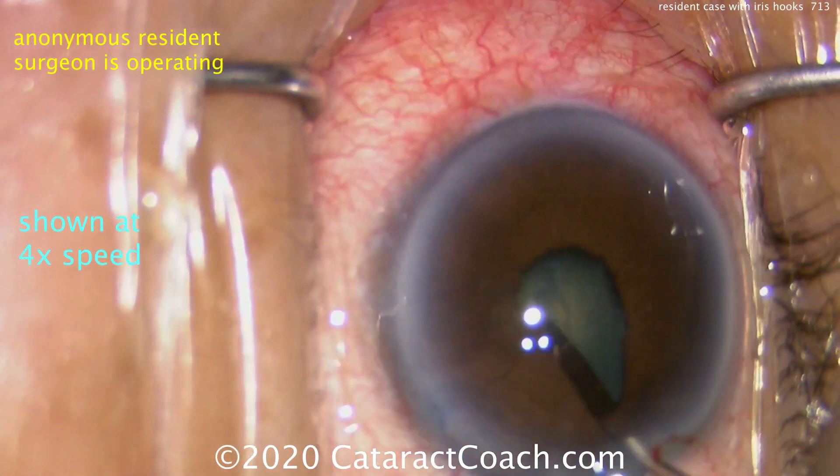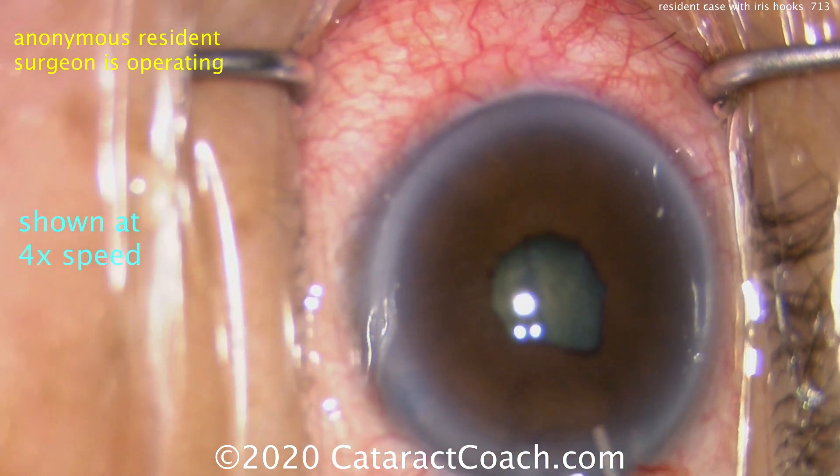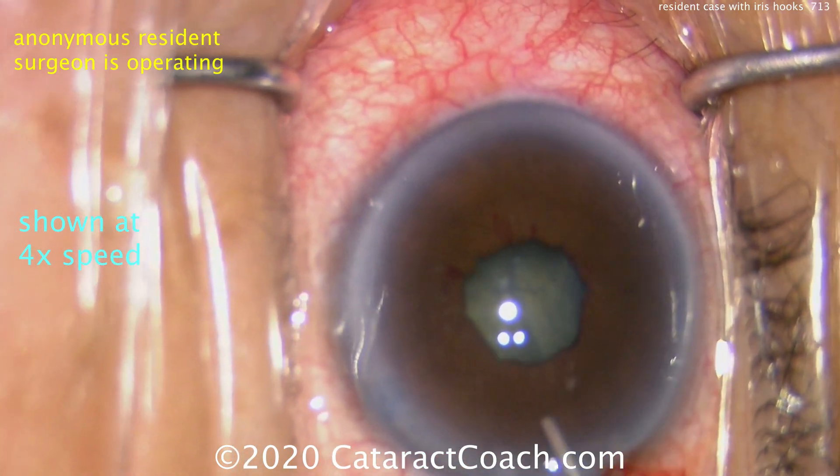Now a little bit of hydrodissection is being done. You can see there's a tendency for iris prolapse, and the pupil became small again. So this is probably a good time to say: let's put in some iris hooks.